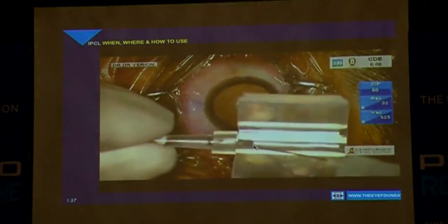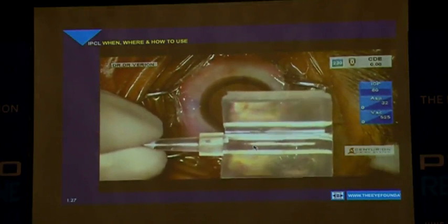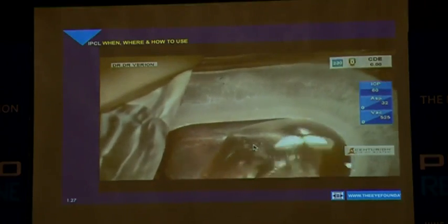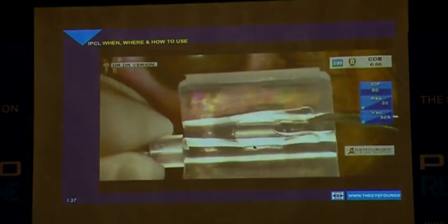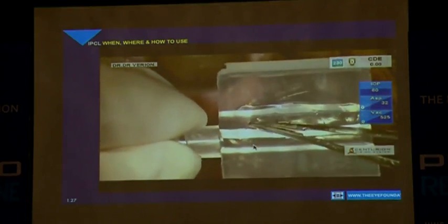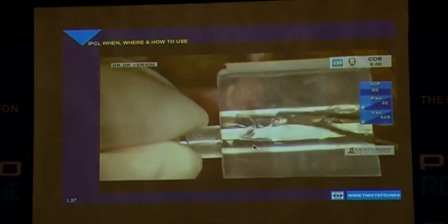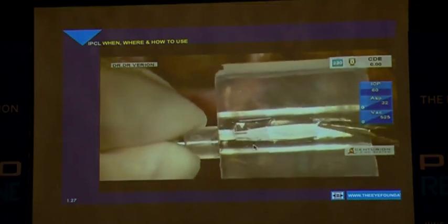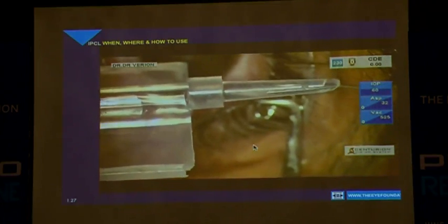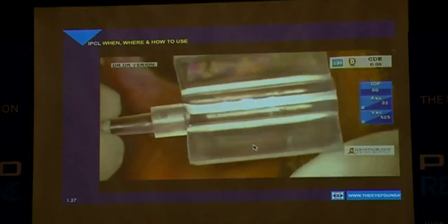As I said, loading of these lenses is very similar to the hydrophilic acrylic lenses. The only thing is, you do not use viscoelastic in these situations, but just use saline or BSS, and then place these lenses and make sure these soft lenses are tucked in below the flanges of the loading haptic, and then gently close it while you are pressurizing on the central area.